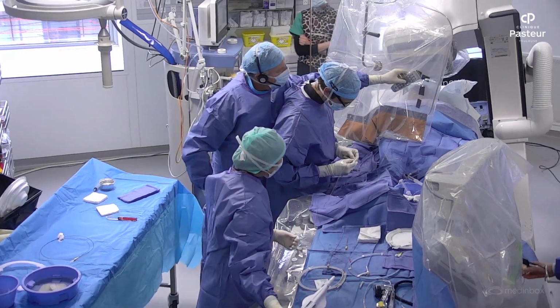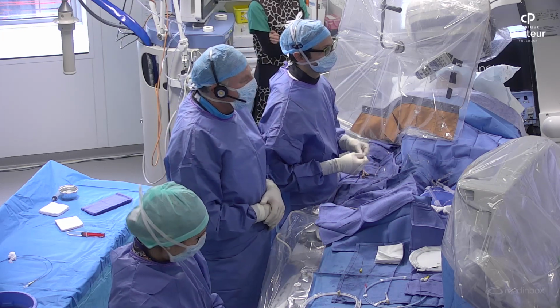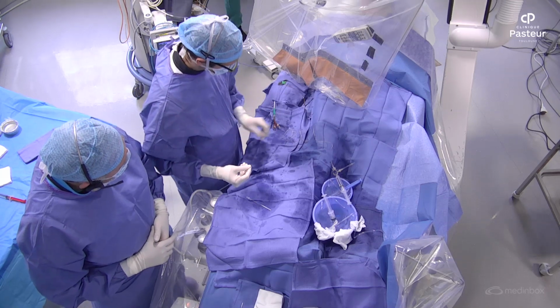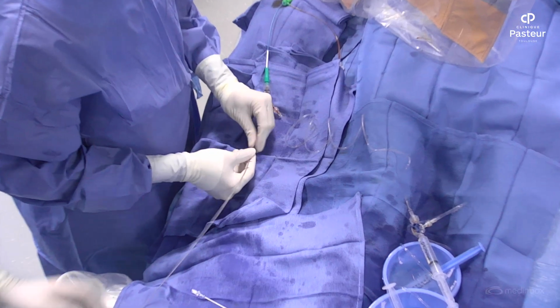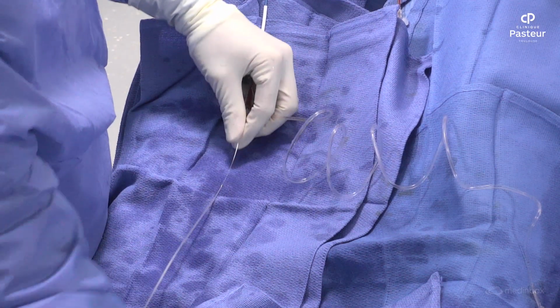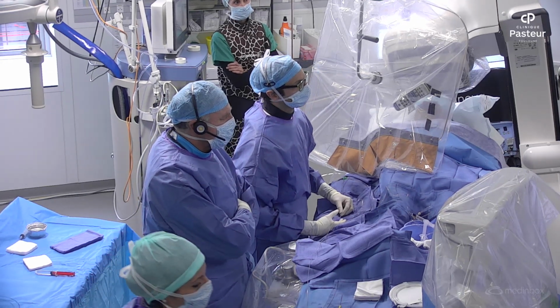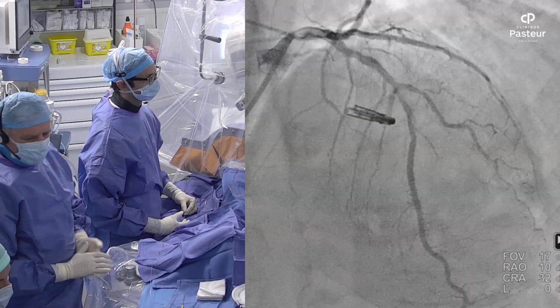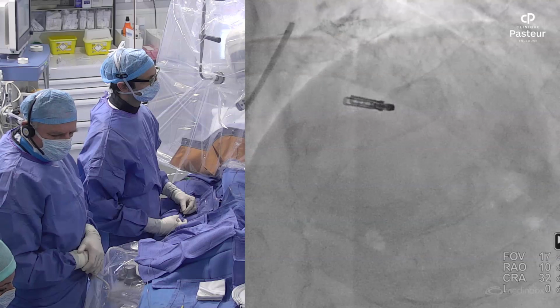Okay. We give you the time to work, but I'm sure that what you have proposed is a very provocative case, because until a few years ago, nobody would have thought to treat a patient totally percutaneously on the valve and on the coronaries. This used to be a typical surgical case of ischemic complication, probably on the mitral valve, requiring a valve replacement or repair, and at least 2 or 3 bypass grafts. Now, the fact that you do this percutaneously, it's great. I just want to see from our colleagues their opinion, whether some of you still consider that this patient should be treated with surgery. Raise your hand. Only 1 or 2 people would send this patient to the surgeon. So it's great to see that what you are doing is in line with what we think and know, and the potential of percutaneous medicine.